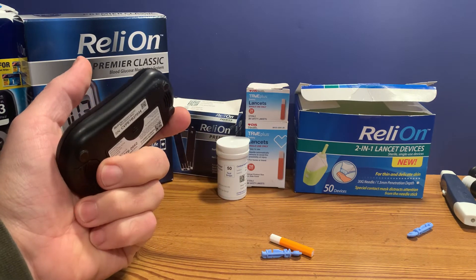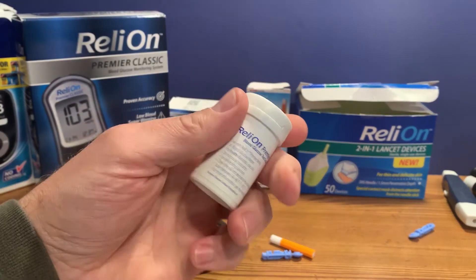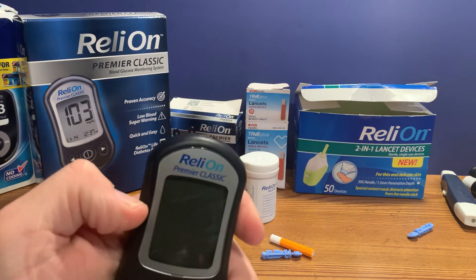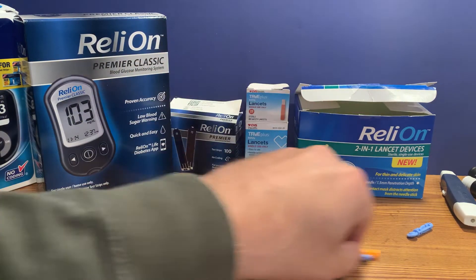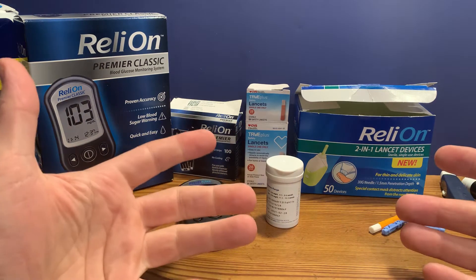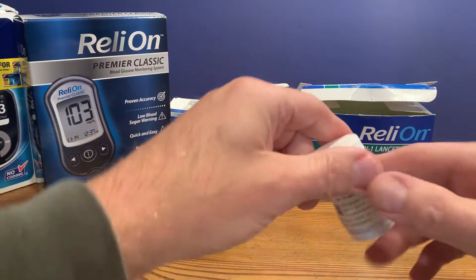It's an inexpensive meter, and of course you'll want to use the correct test strips. This is a Premier machine, so we've got the correct test strips for it. First of all, we want to wash our hands with warm soapy water — we want to ensure that our hands are clean and dry.